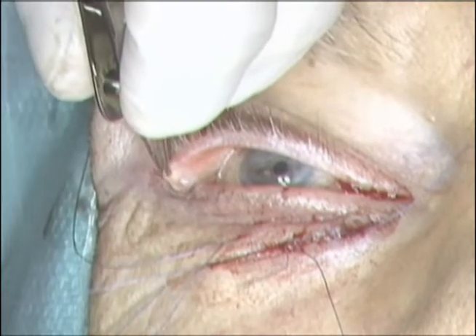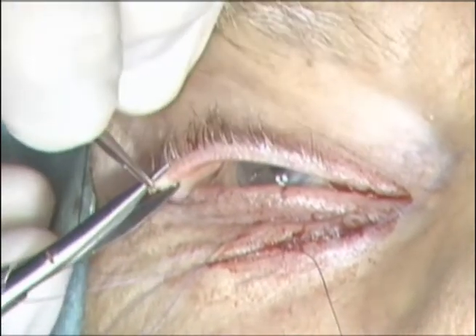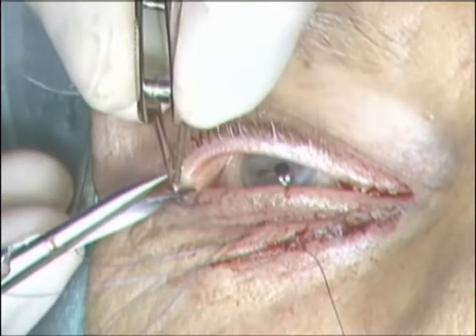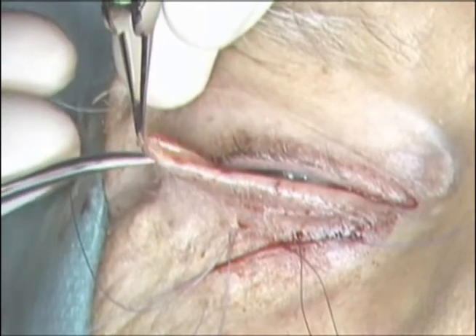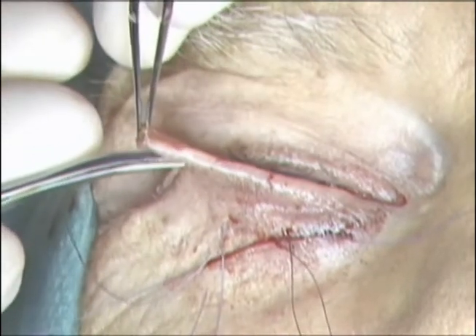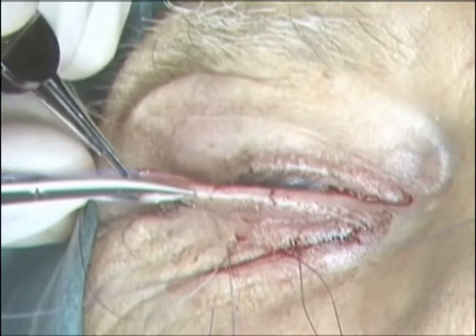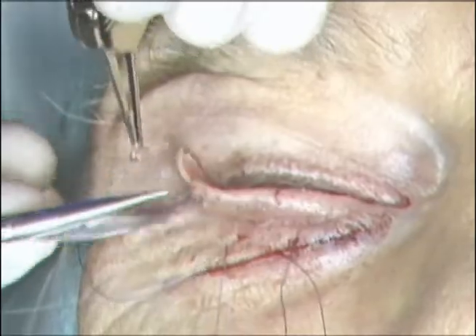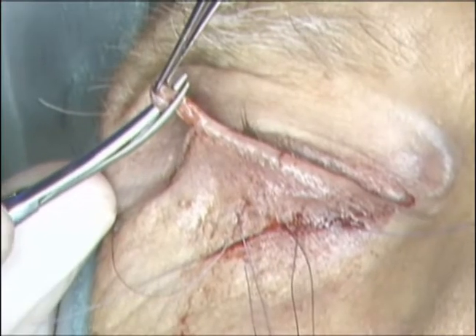Attention is then directed to the lateral upper eyelid where the lateral 5 mm of the mucocutaneous junction is excised for the subsequent lateral canthoplasty. The upper canthoplasty is performed to give additional support laterally to repair the ectropion. A lateral tarsal strip is then fashioned by dissecting between the anterior and posterior lamella for approximately 1 cm. The mucocutaneous junction of the posterior lamella is then excised with the Westcott scissors. The posterior surface of the strip is then scraped with a 15 blade.